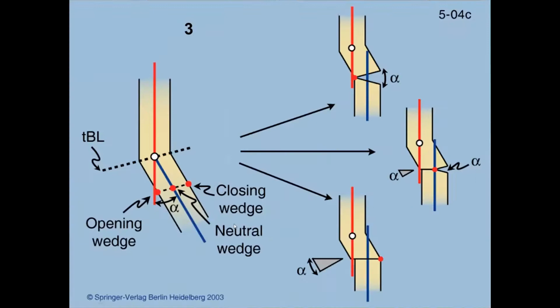Osteotomy Rule 3 is the unwanted rule, and that's where you identified the CORA correctly. You decided that you had to make an osteotomy away from the CORA, or the center of rotation, which is fine, but you didn't rotate around the CORA. You rotated around your osteotomy, or you made your deformity correction about the osteotomy, not about the CORA or the apex.